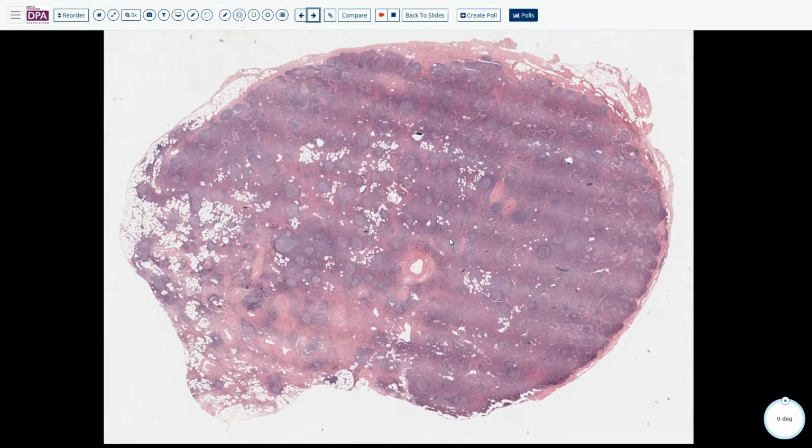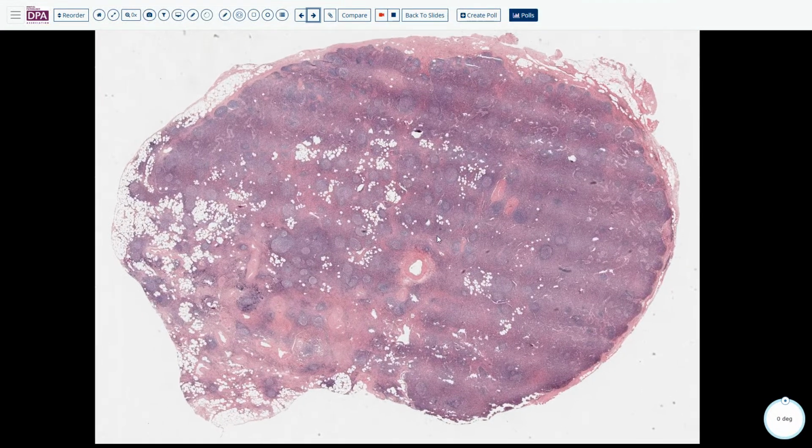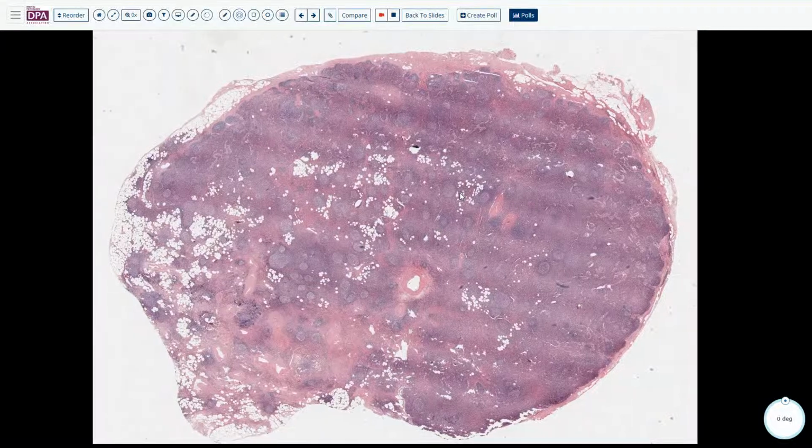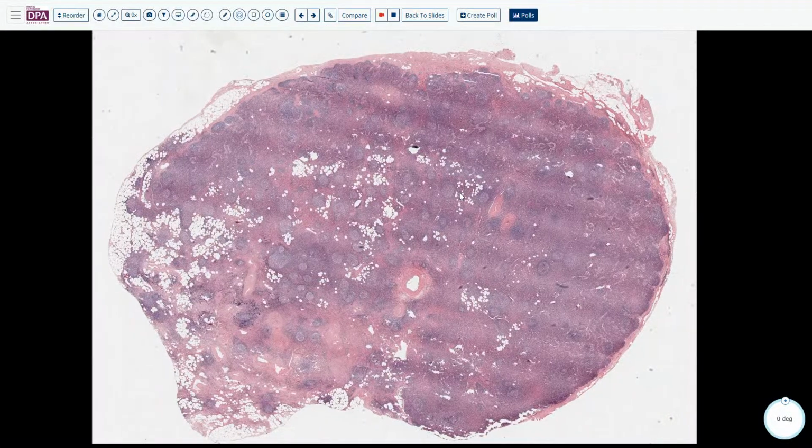So, and then this case is a little bit difficult. Anyone want to try this one? I can do it. Oh, sure. Sarah, if we want to do, yes.